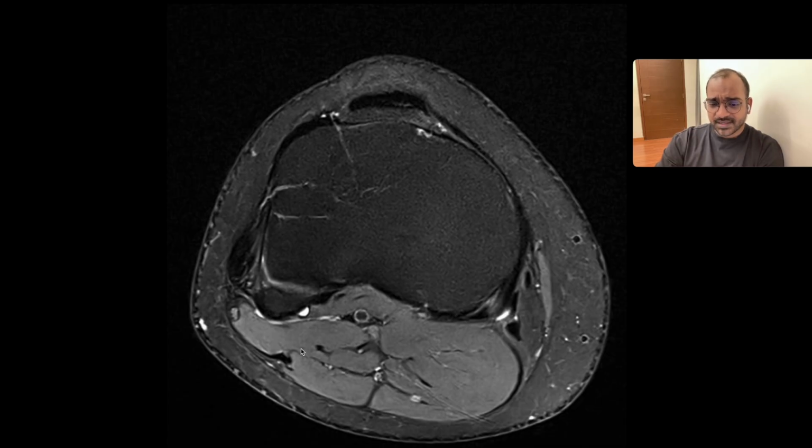What is pes anserinus bursa? Pes anserinus bursa is a bursa between these three tendons, which are getting inserted onto the proximal aspect of the medial tibia. So what are these three tendons? Sartorius, gracilis, and semitendinosus. So this is called pes anserinus bursa. We can observe there is minimal fluid right now, which is normal. Usually bursal walls will be thickened, with soft tissue inflammation and fluid.